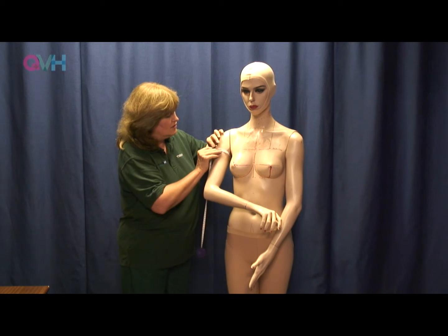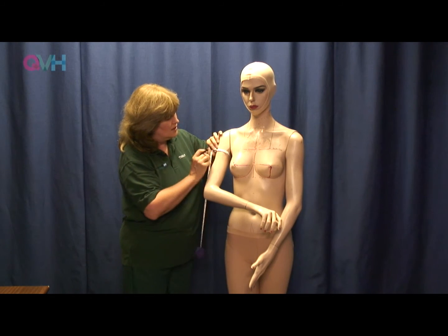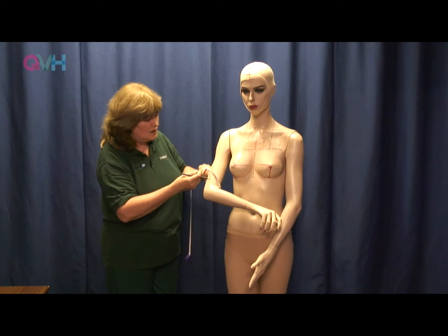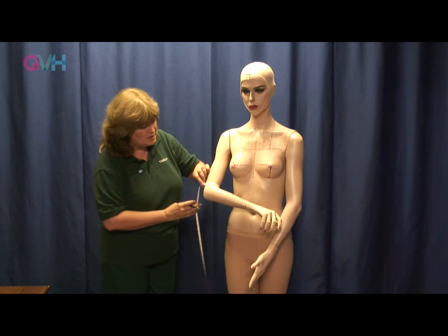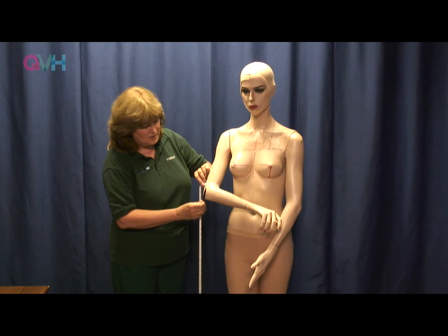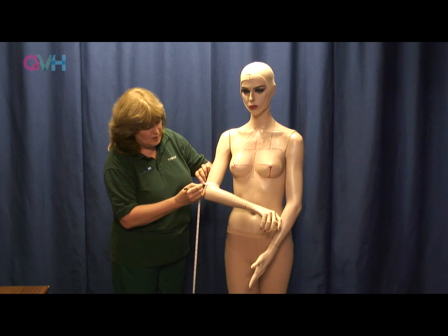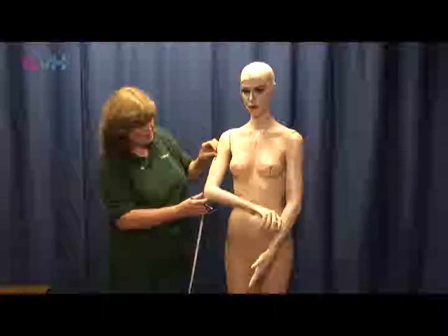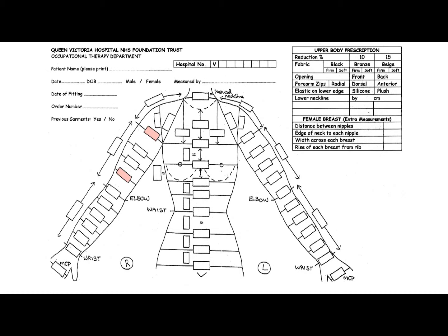Now it's a little hard on this lady because she is slippery, but I would mark that and record the circumferential measurement, and then I would record the next circumferential measurement. And with the arm at right angles as she has it, you can see that it wouldn't travel onto the apex of the elbow, so I would mark there, and then I would divide that distance, which is 18, and if we're going to use all the boxes, you'd see that I would probably use 3 of those boxes, because we're not quite on the elbow, we're actually where the elbow creases.